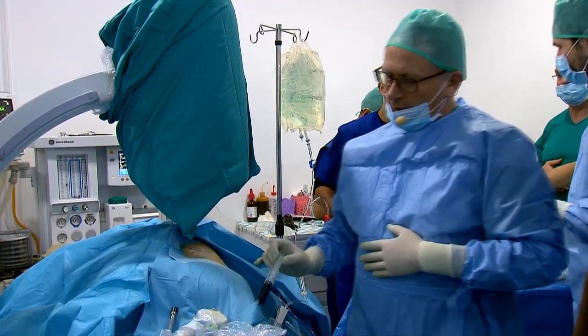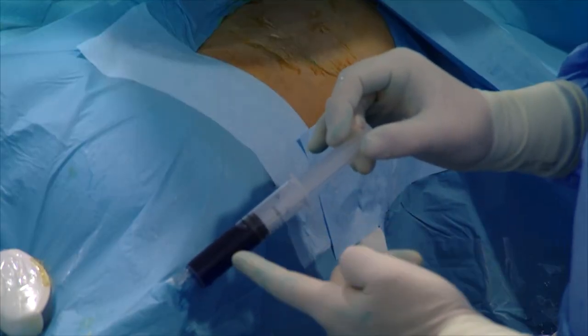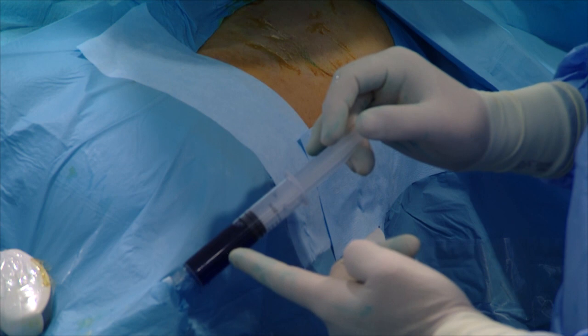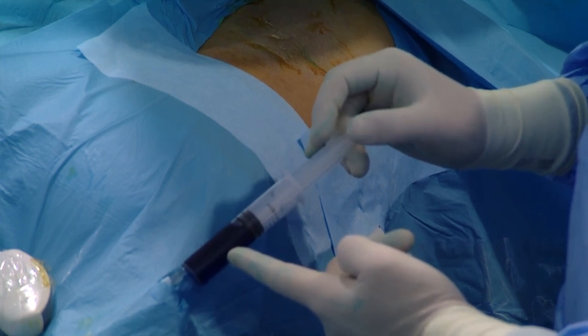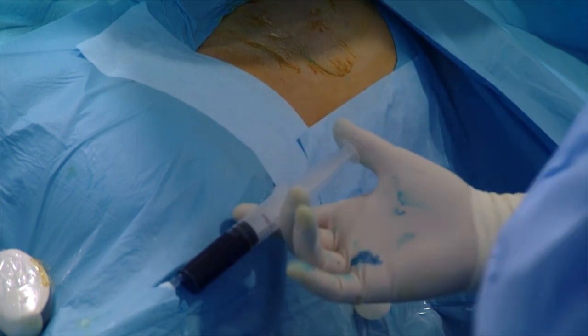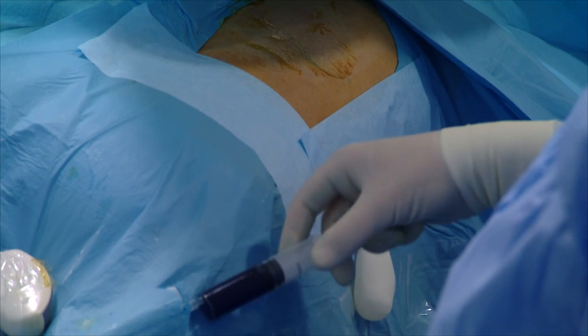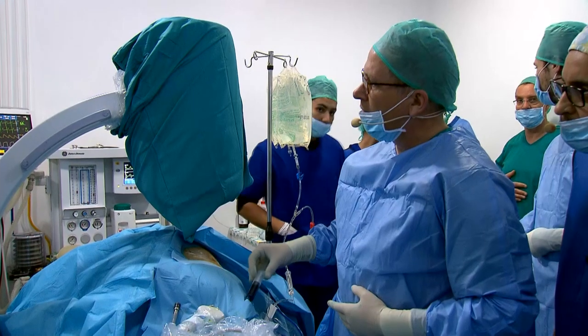The next important step is that we have our ureteral catheter here. This is a mixture of methylene blue and contrast dye. And what we now do is we apply a certain contrast dye and have a look at the X-ray. Please, X-ray. More. Continuous.